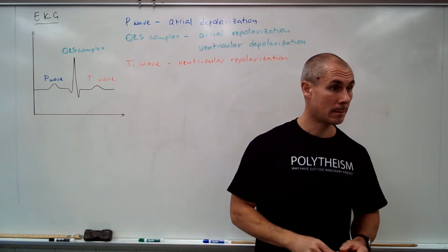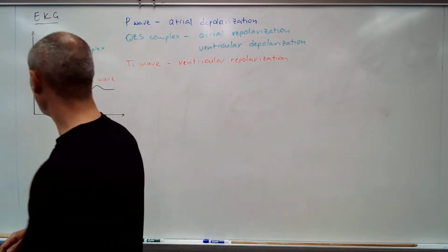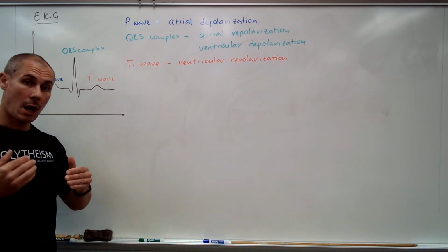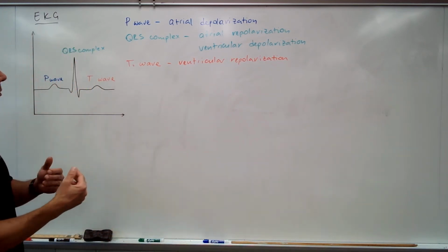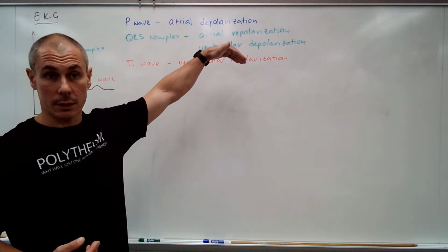We're good? So, why do we care? For instance, if you look at the PR interval, you can see how long it takes from atrial depolarization to ventricular depolarization.